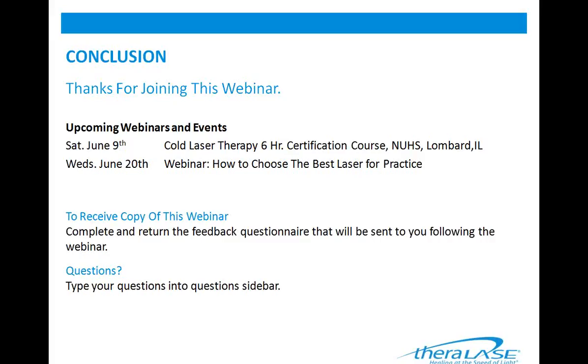Well, that's a good question because we do have a shockwave unit at one of our offices, and both units are great, but both units can be applied specifically to certain patients. For example, if I have a patient coming in with osteoarthritis of the knee and it's a senior patient who's about 70 years old, I'm definitely not going to be using shockwave because shockwave is very intense.